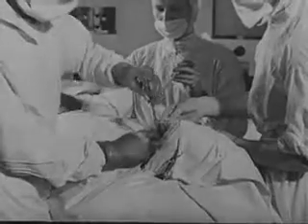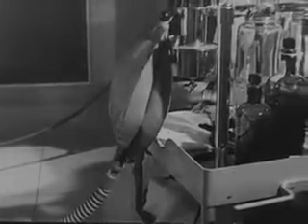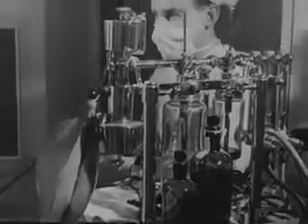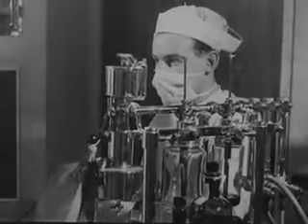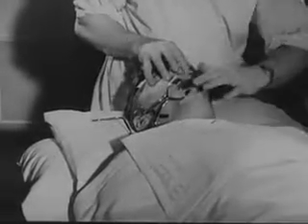Once a free airway is assured, the anaesthetist and his apparatus can be completely clear of the field of operation. By watching the movements of the rebreathing bag, he can detect immediately any change in the character of the patient's breathing. By packing the patient's pharynx with gauze, he can be protected from the entry of blood into the trachea.